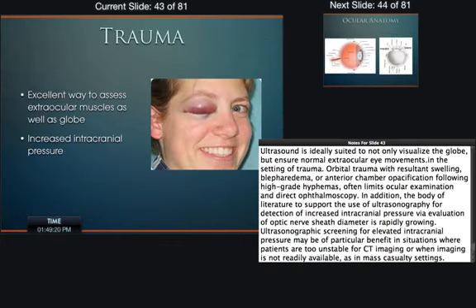And then we can also use this for patients with increased intracranial pressure. Sometimes with an eyelid, like this person right here, this would be a difficult and painful process. How would you retract that eyelid when it's that swollen? What would you do? That's right, you take two paper clips, and you can get them underneath the eyelids and pry them open that way. But patients hate this. When you have this much blepharedema, or somebody with a big shiner like this woman who's very happy that she's got this black eye, you can do ultrasound there by putting a lot of chilled gel on the orbit. You can assess what's going on, especially in patients who have altered mental status, where you're not sure, they could have a head injury. We have a surrogate marker for their intracranial pressure.